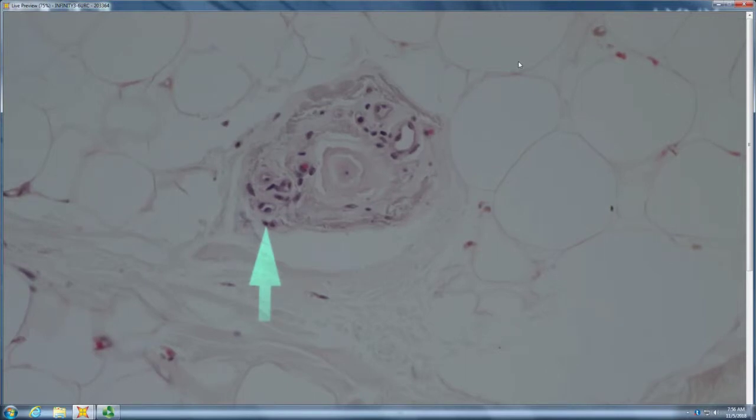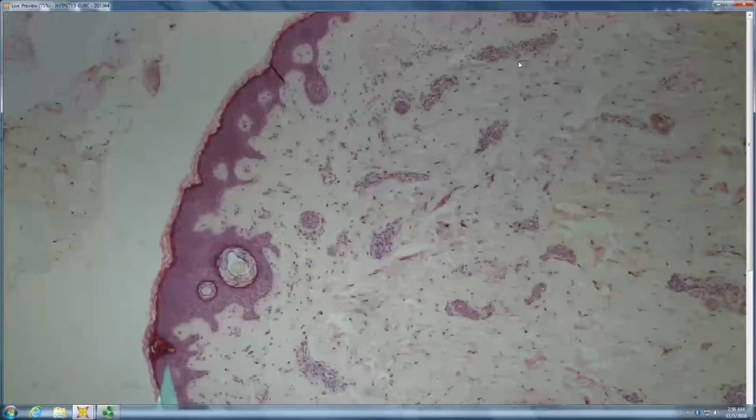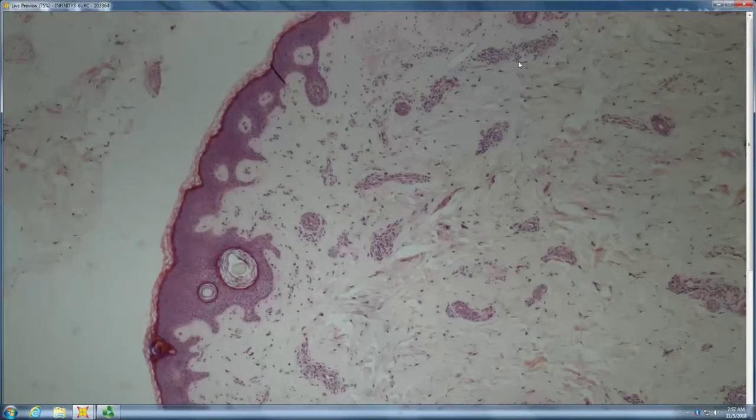So what's your differential? A non-scarring, non-inflammatory alopecia with variation in hair size, so pattern alopecia most likely. You'd look for other signs of alopecia areata. We had the benefit of having a vertical section. Do you see any Swiss cheese dilatation of the infundibulum? Not so much. So it's really starting to look like pattern alopecia in someone who's got a little sebderm too. Where people get hung up is that little bit of lymphoid inflammation that they want to call an inflammatory alopecia. That's just sebderm background.